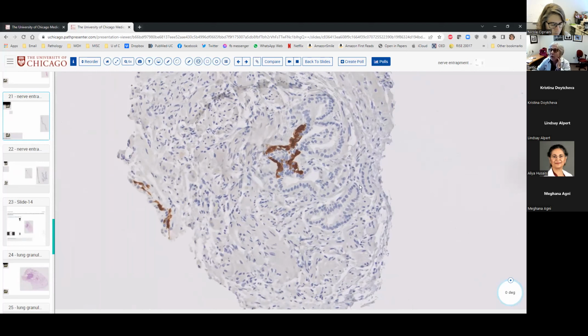I know that some of you always have these questions about what if one gland is negative and the rest has staining. Again, when you have atrophic glands, the basal cell layer is not continuous. As you know, it's very random. You can have one gland with one basal cell, one with none, one with 3 or 5. Therefore, you have to decide if all glands look the same. If they all look the same morphologically and you have some basal layer, these glands are benign, okay?